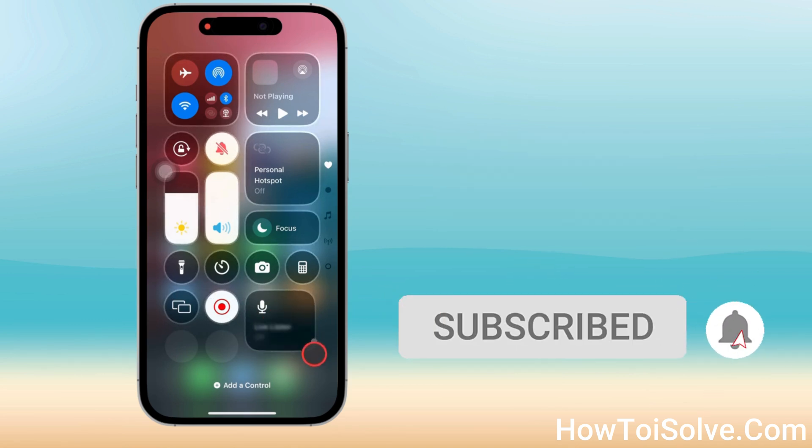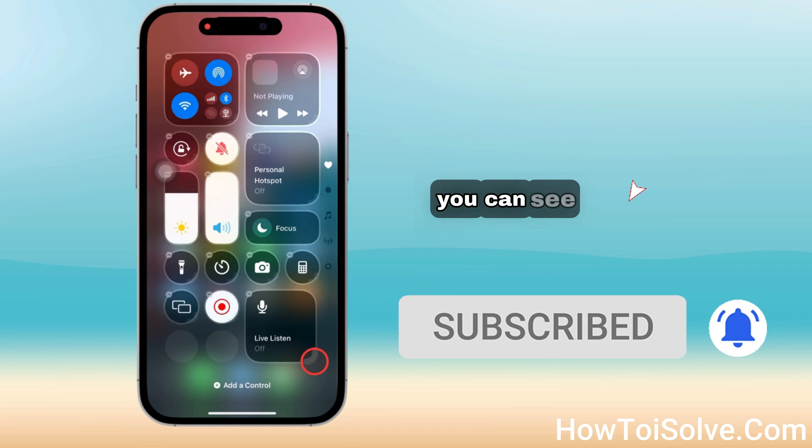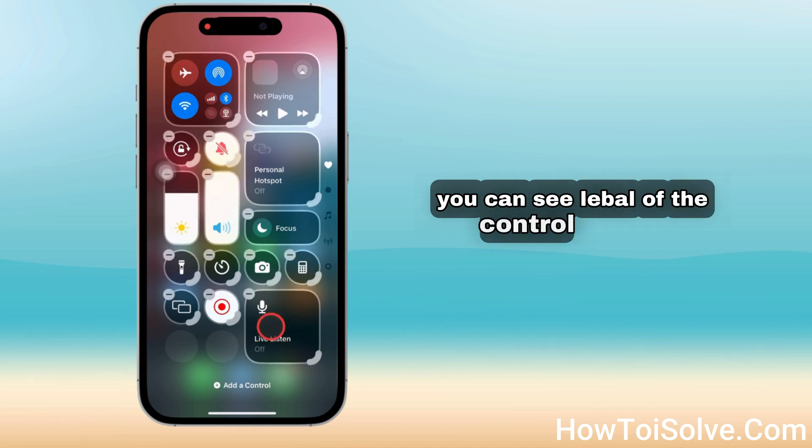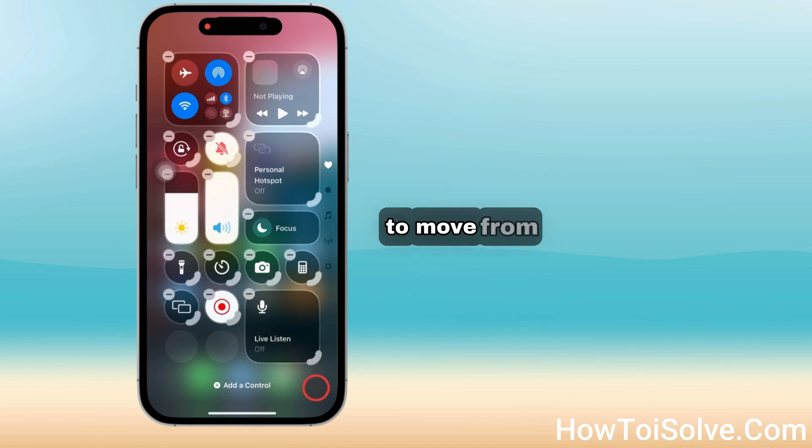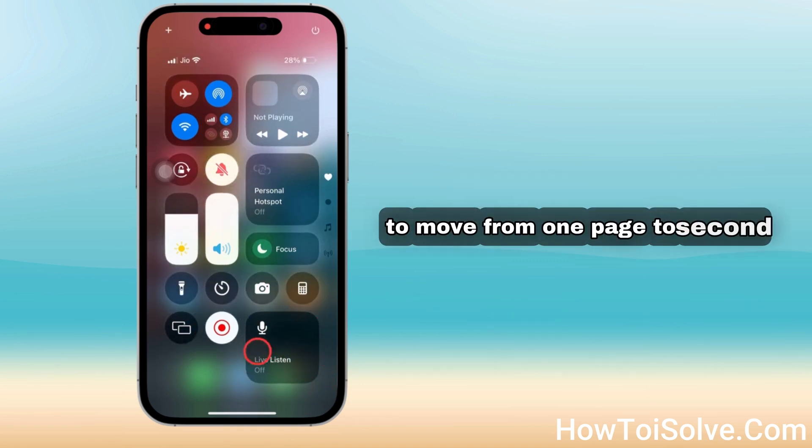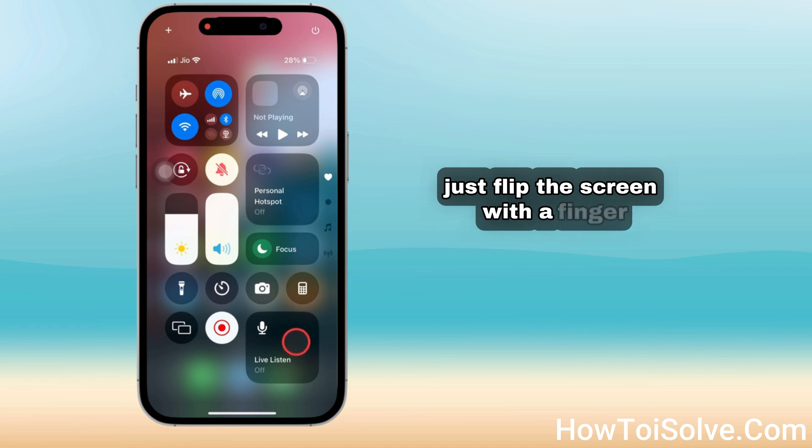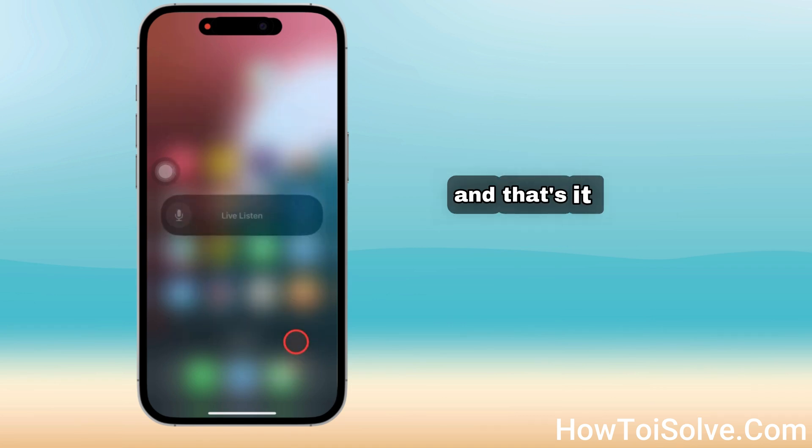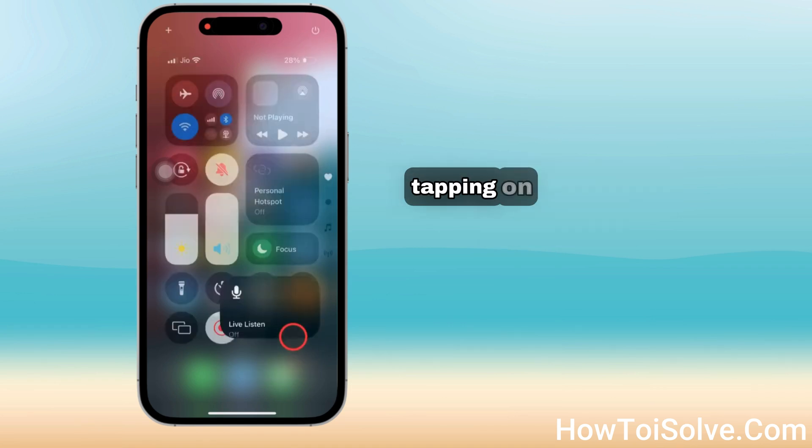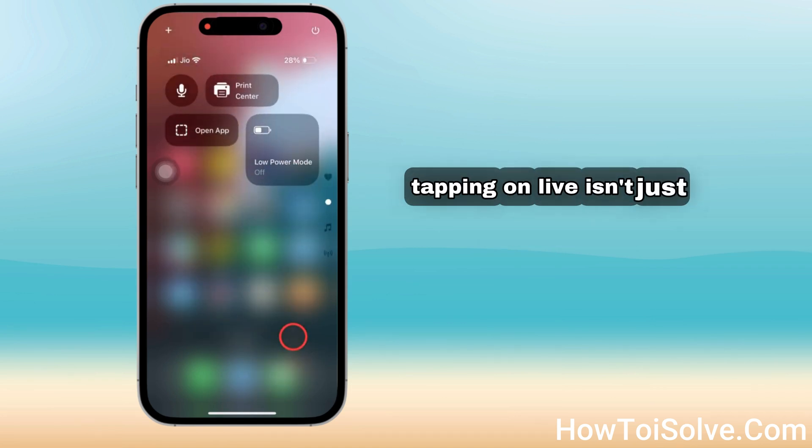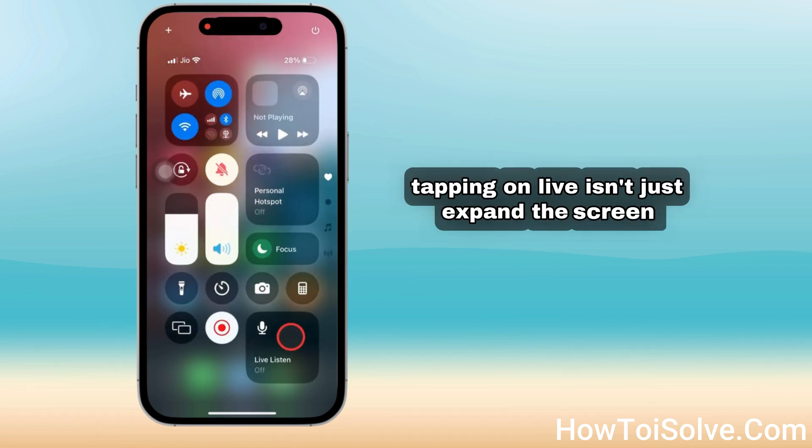You can see the level of the control like this. To move from one page to a second page, just flip the screen with a finger. Now tapping on Live Listen will expand the screen.